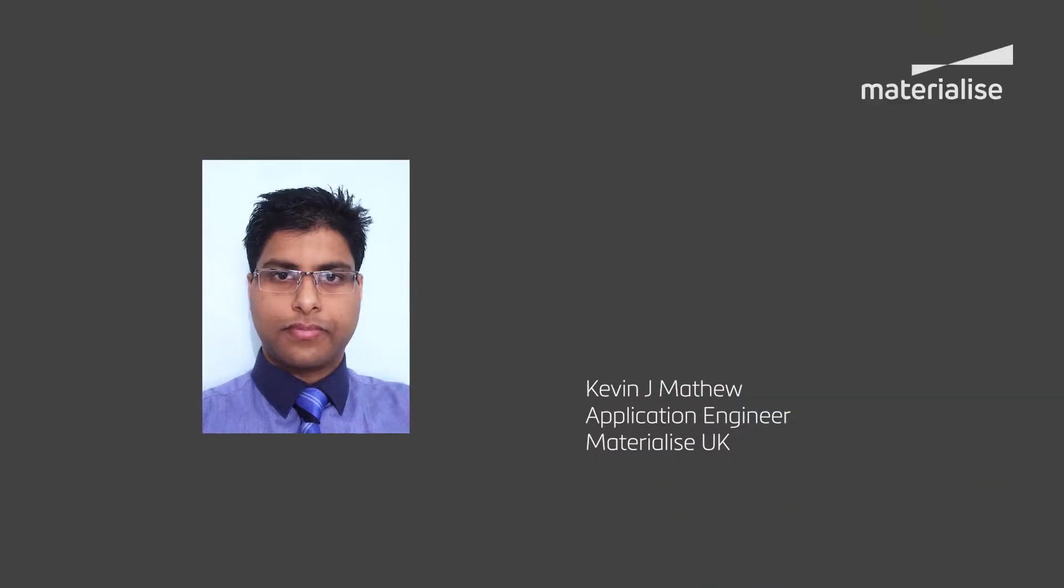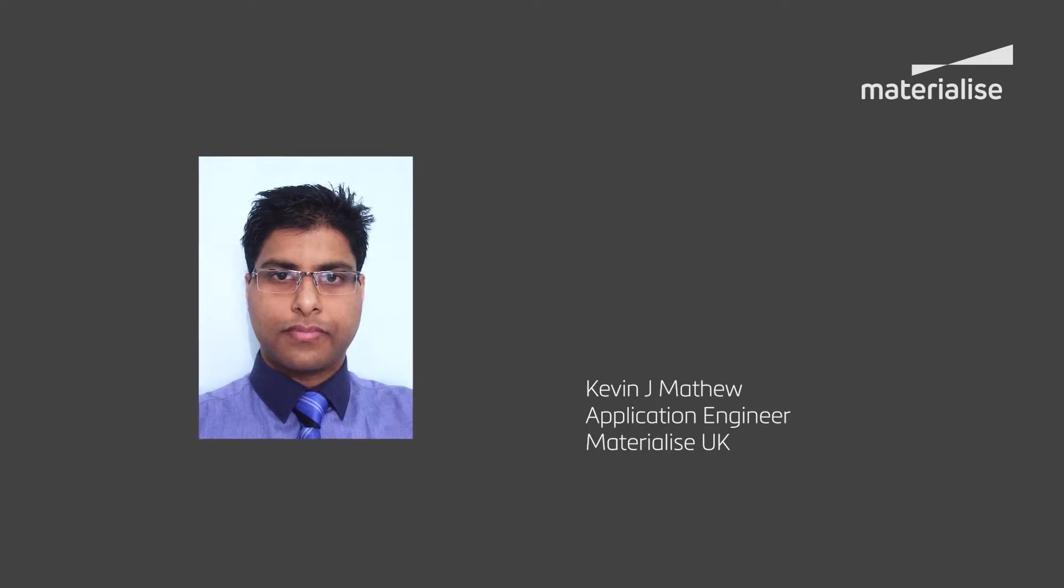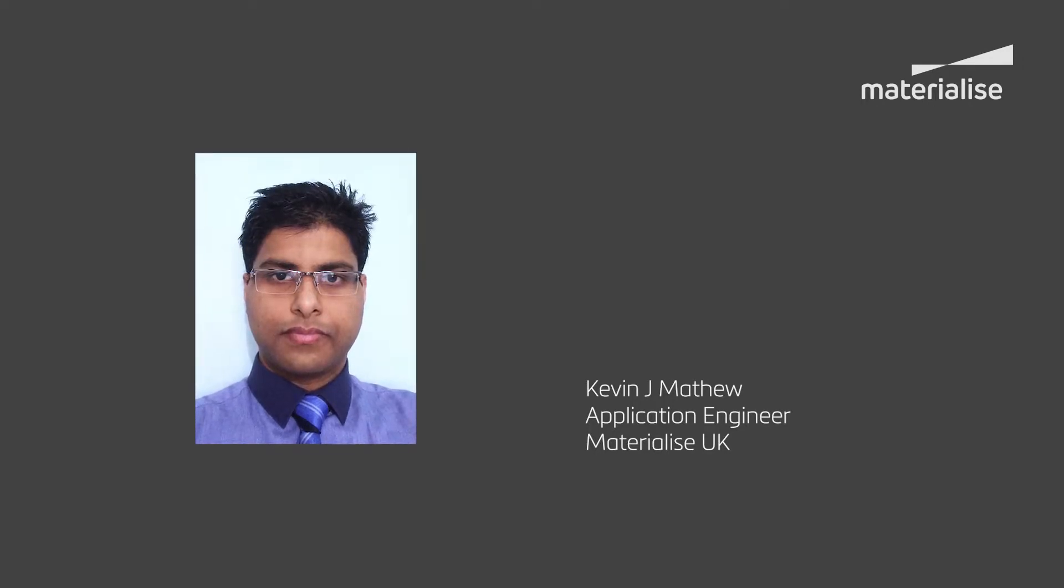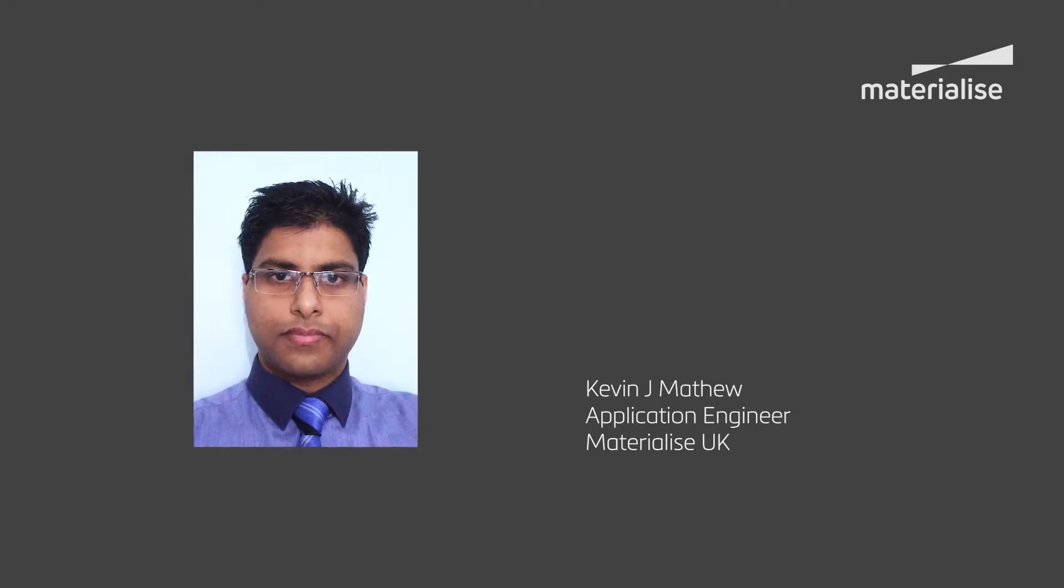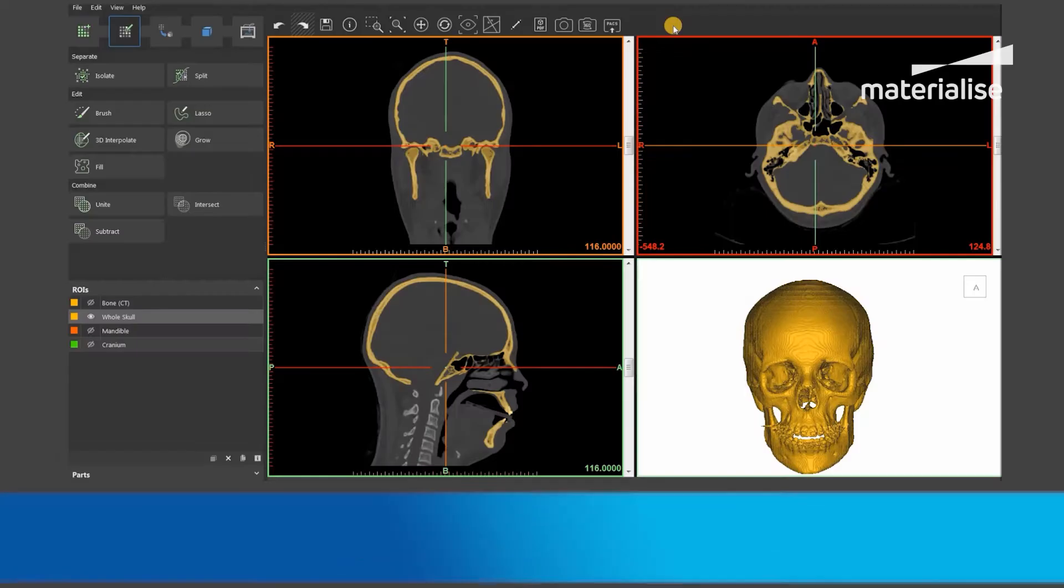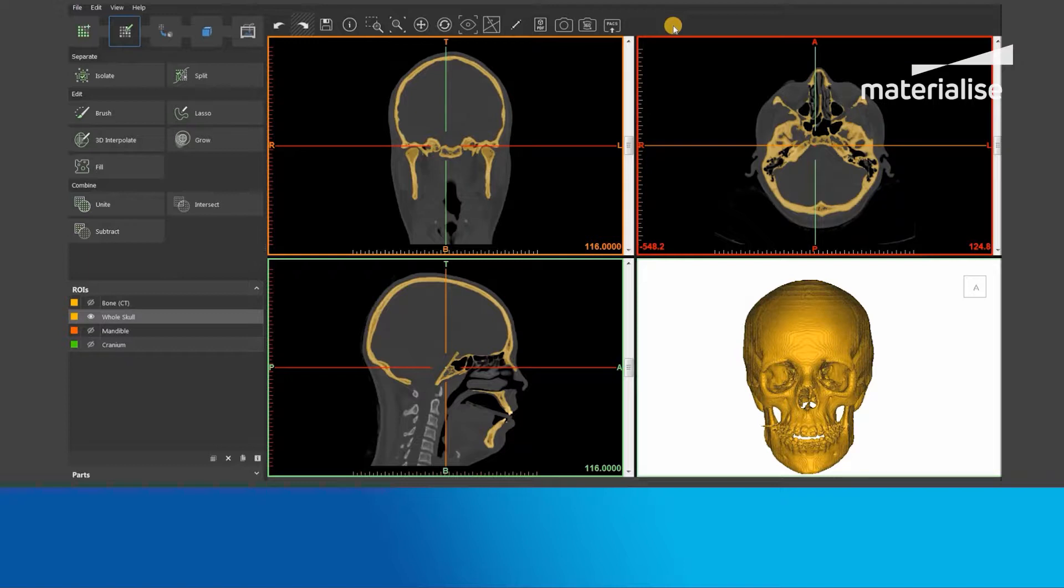Hello, I'm Kevin J Matthew from Materialise UK. Today I'll be showing you how to use the Export 3D View and Send to PACS tools to send 3D models back to the PACS system within Materialise Mimics Imprint.